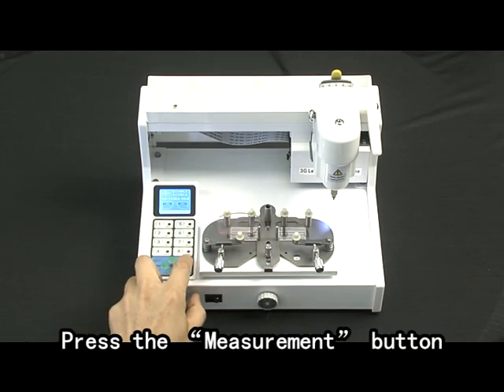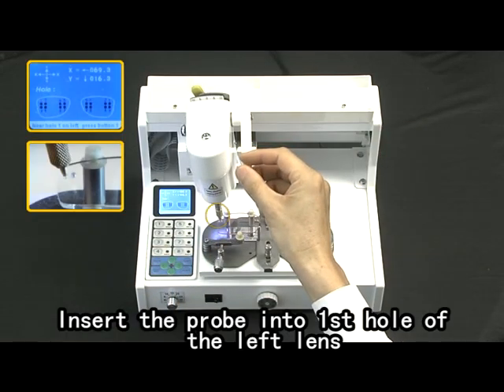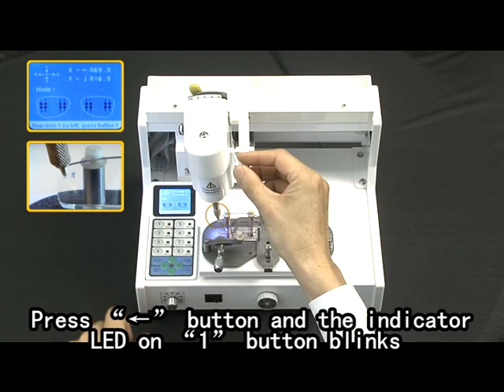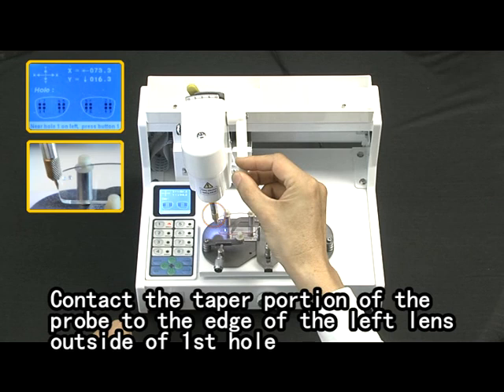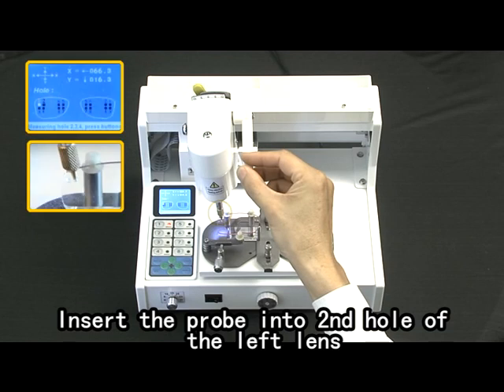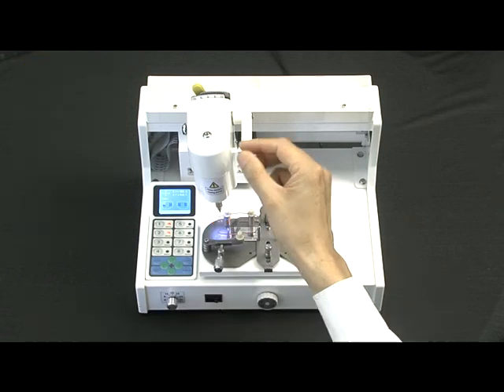Press the measurement button. Tilt the head to the left. Insert the probe into the first hole of the left lens. Press the left arrow button and the indicator LED on the one button blinks. Contact the taper portion of the probe to the edge of the left lens outside of the first hole. Press the one button and the indicator LED lamp on one button turns on.